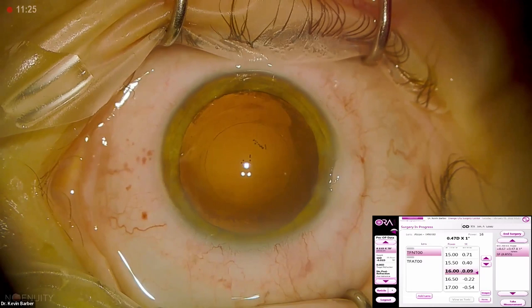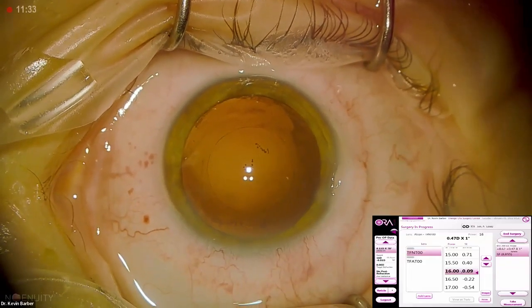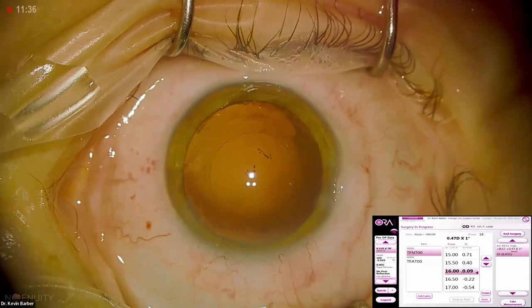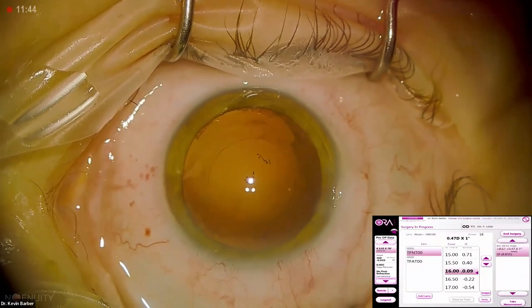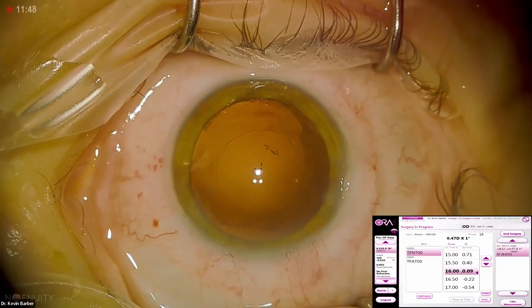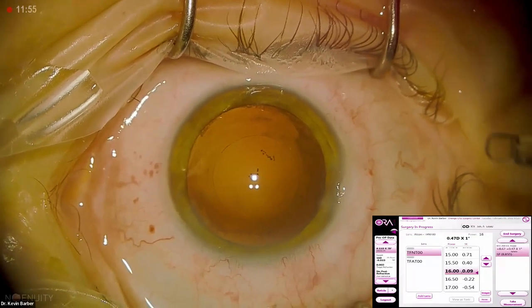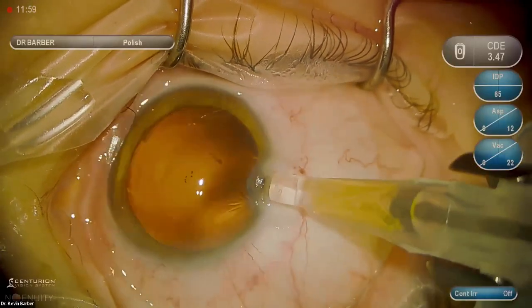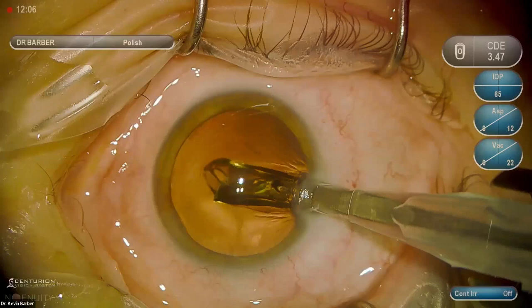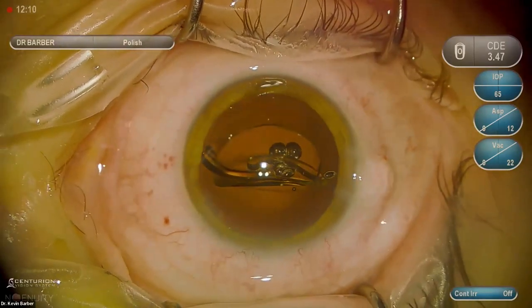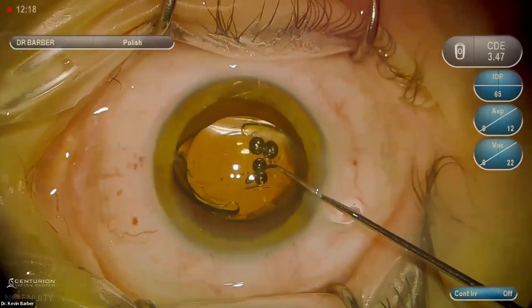The intraoperative aberrometer is confirming the lens we pre-selected — the 16 diopter. In this case, aberrometry is just confirming the biometry done preoperatively. I do not change the capsulotomy size between ATIOL cases and regular cases because consistency is key. The capsulotomy size influences your ELP — effective lens position. If the lens sits more anterior or more posterior, that changes your refractive outcome, so you really want a consistent capsulotomy.